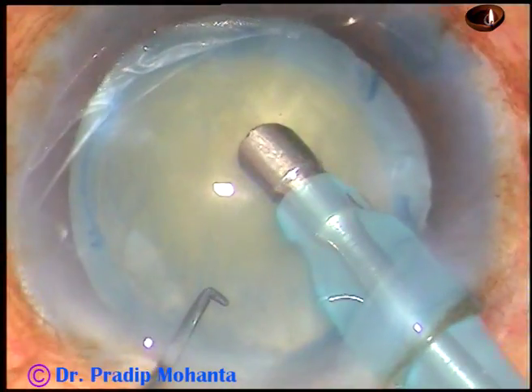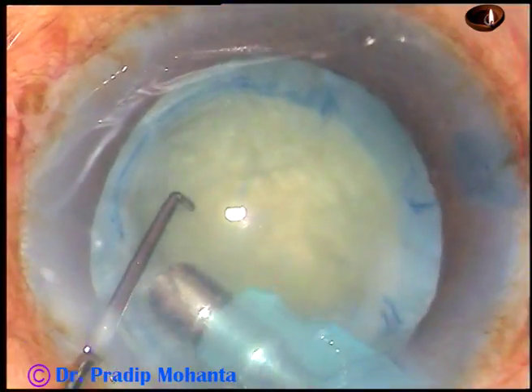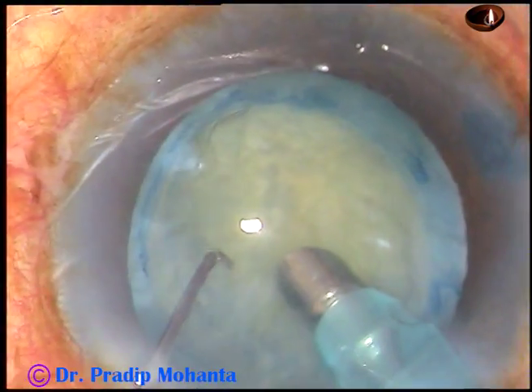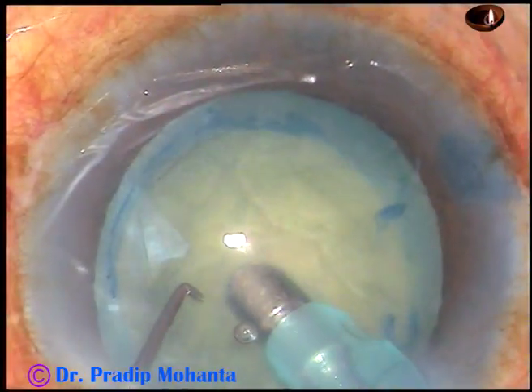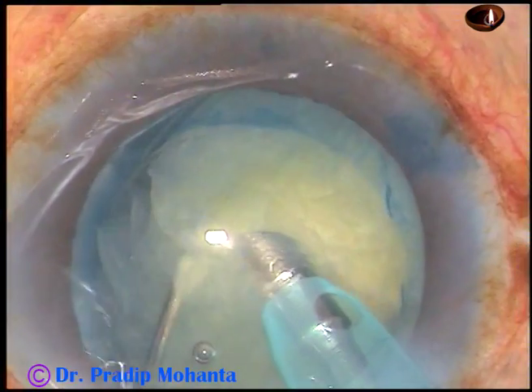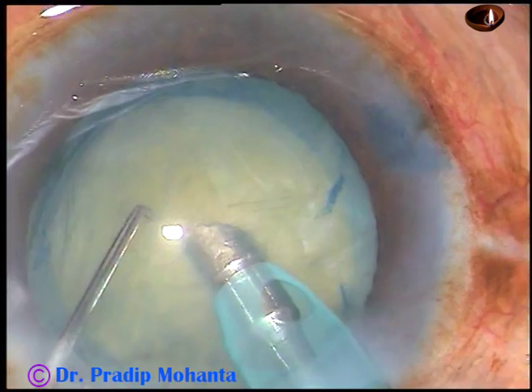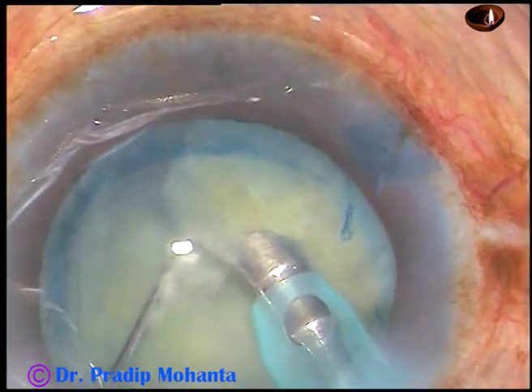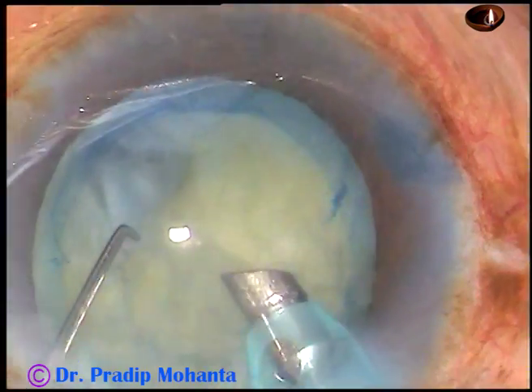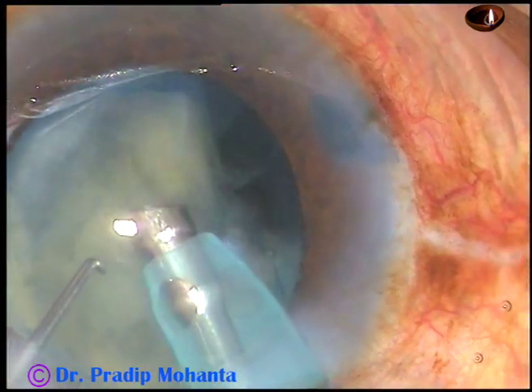Now is the time to introduce the tip of the phaco handpiece into the anterior chamber, removing some cortical matter. The anterior chamber now has some depth. I am holding the nucleus with bevel down and making this chop. At this time the bevel is sideways. The nucleus is soft and brittle, and it is getting chopped and emulsified very fast.